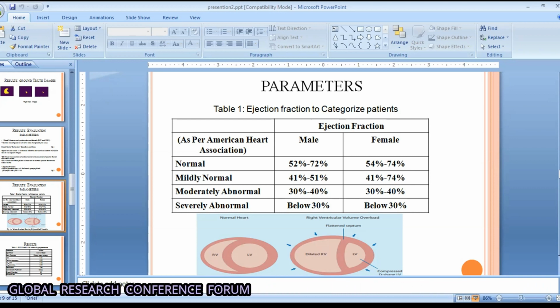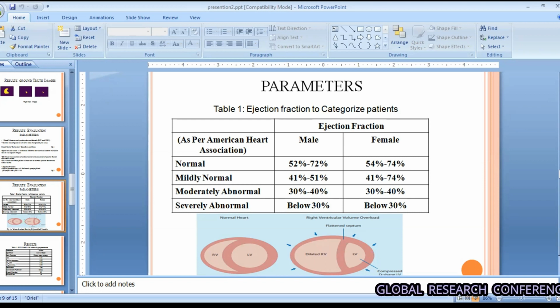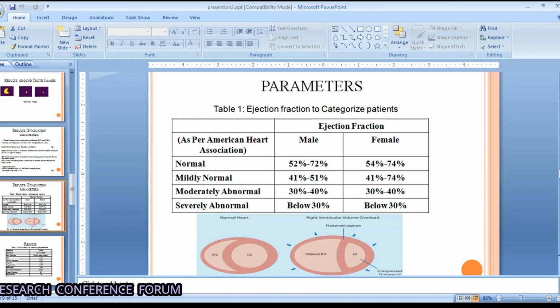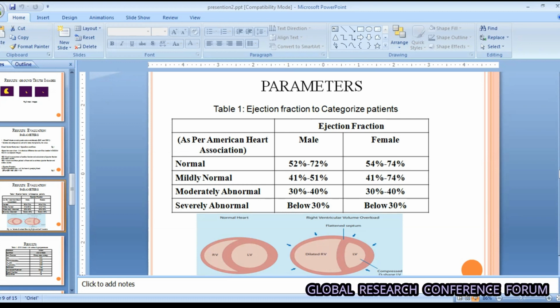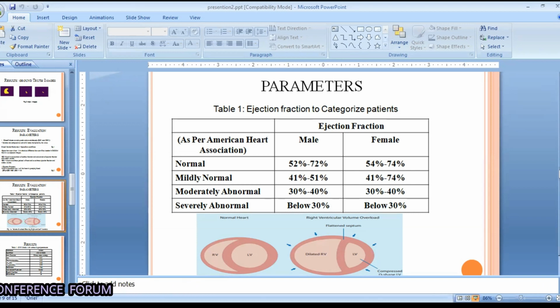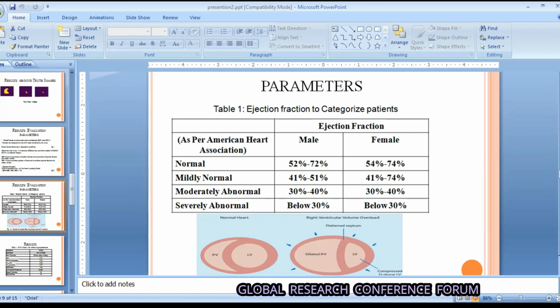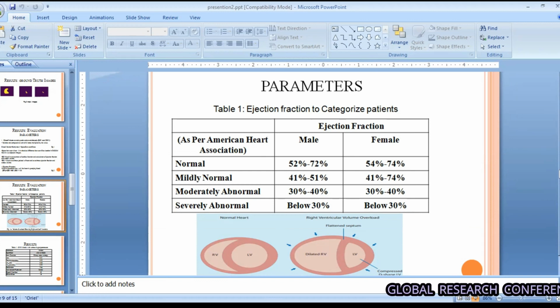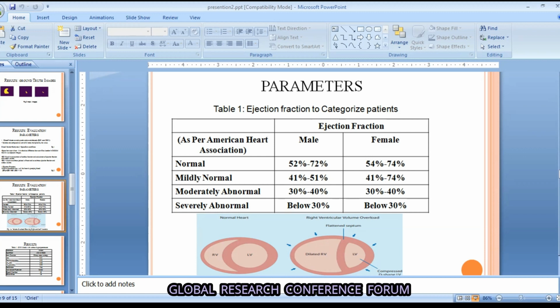So the conclusion of this paper presentation is that accurate contouring is a crucial step in blood volume measurement of right and left ventricle. The proposed convolution neural network is used for precise identification of right ventricle. Our model with ADAM optimizer provides 99% training and validation accuracy. And in the case of end systole volume and end diastole volume, 93.27 and 90.28% accuracy we have achieved at endocardium boundaries of the cardiac short axis MRI images.